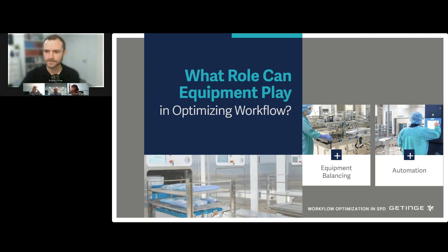That was a mistake at one of my prior facilities that was made before me in the department. And it's like, well, how do we process this stuff now? So just kind of keep that in mind as well. Secondarily, I just want to touch on the fact, back to the people, back to the users. You want equipment that's going to be efficient, but also ergonomic, which brings in the automation piece that Andy alluded to as well. So you definitely want to keep your people in mind.